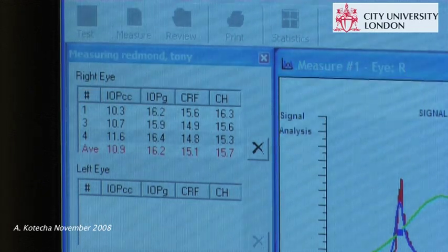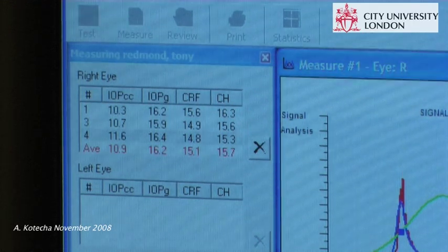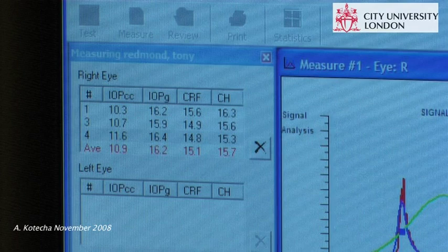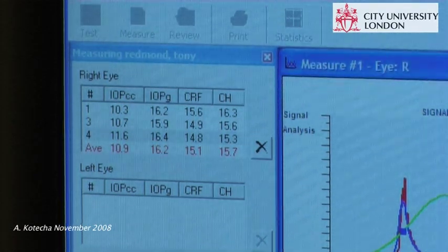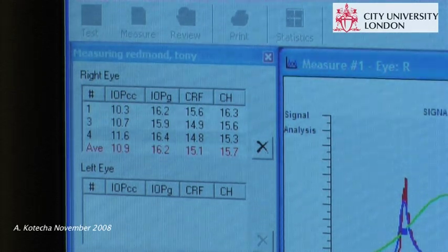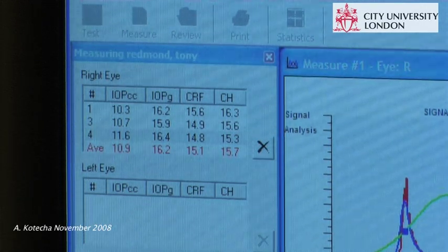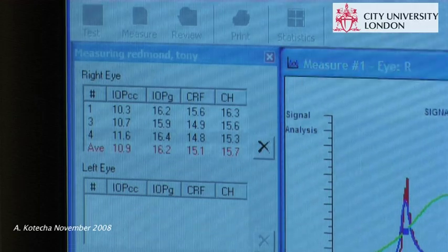This subject has a highly viscous cornea, and you might remember they also had quite a thick cornea. So, the true IOP of this subject will be overestimated when using the Goldmann. Here, the IOPG is significantly higher than the IOPCC, reflecting the effects of corneal properties on IOP measures. However, further research is required to establish the true value of IOPCC.